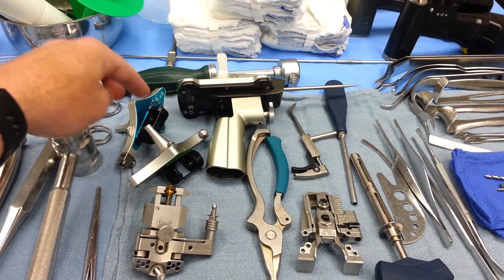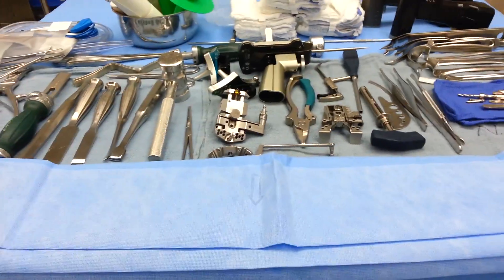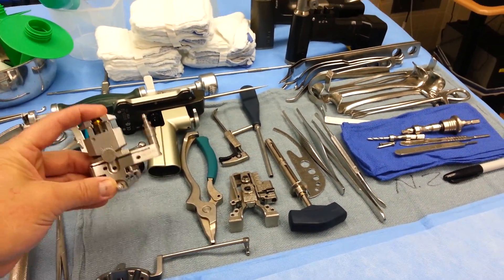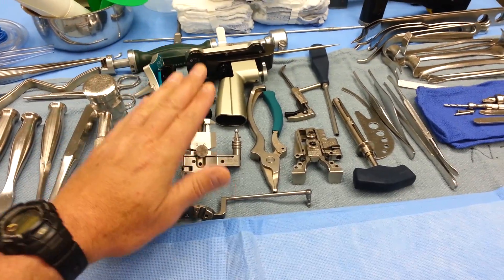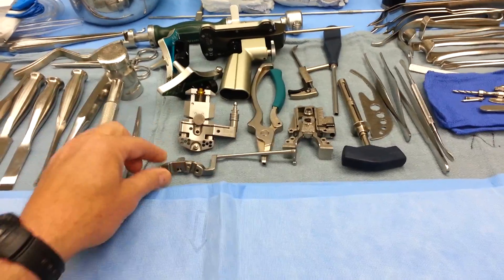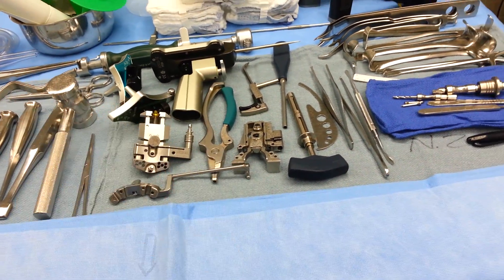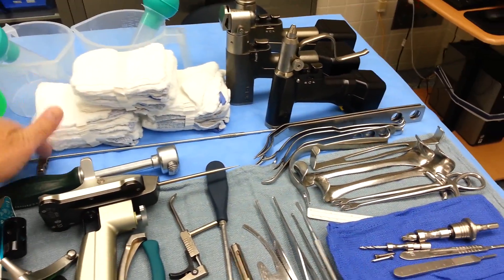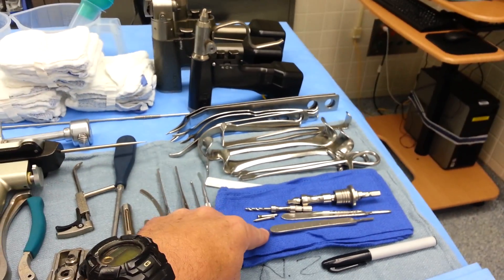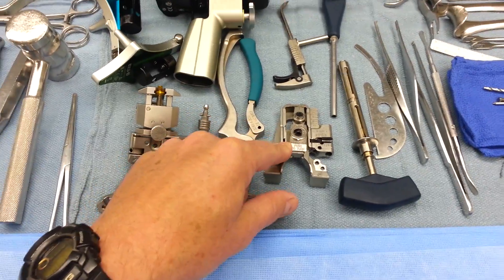You have your navigation trackers here — both of these are instrument trackers and this is your pointer. Those would have batteries in them and be activated with the navigation machine that is separate, non-sterile, and not in the room. This is the navigation bracket. The other side of the navigation bracket is here — these are right and left dependent; this is actually set up for a left knee. Navigation always goes medial, so I can tell by looking at this it's set up for left. Alignment rod, slap hammer. Pin puller and pin driver for the short pins used to hold down the tibial base plate or the femoral sizer.